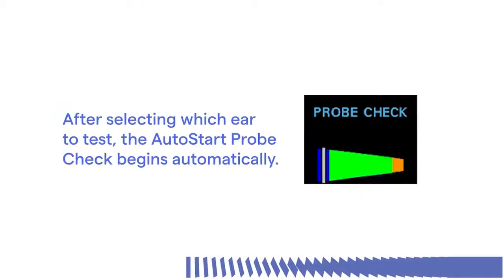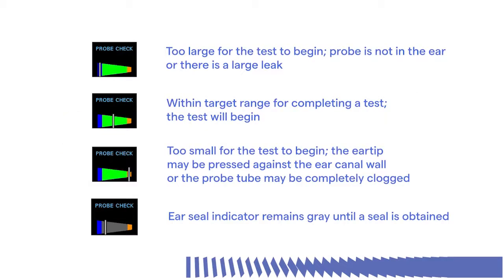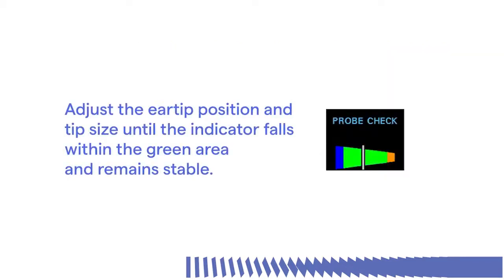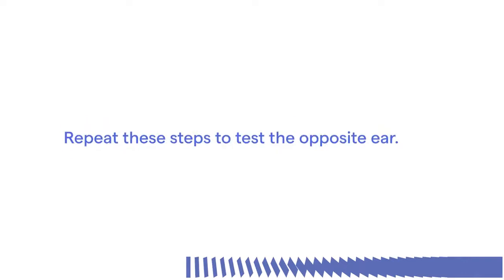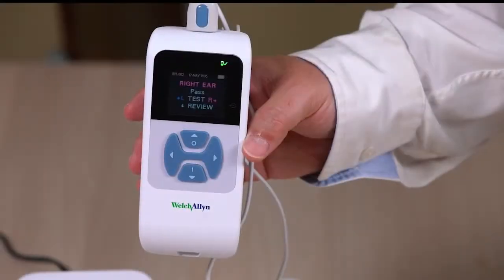After selecting which ear to test, the auto-start probe check begins automatically. The probe check display shows a cone visual on screen, larger at the left and tapering toward the right, representing the ear canal volume from left to right. A vertical white bar appears indicating the measured ear canal volume. Adjust the ear tip position and tip size until the indicator falls within the green area and remains stable. The auto-start check helps improve accuracy, ensuring that the probe is seated properly. Repeat these steps to test the opposite ear.